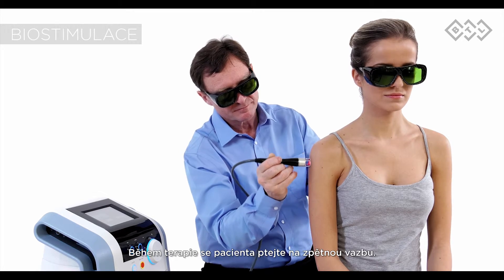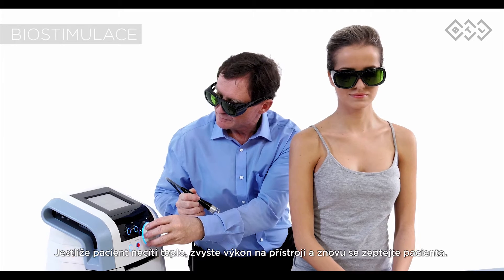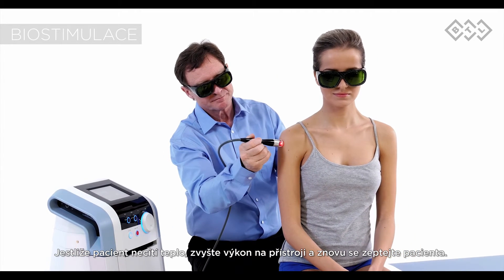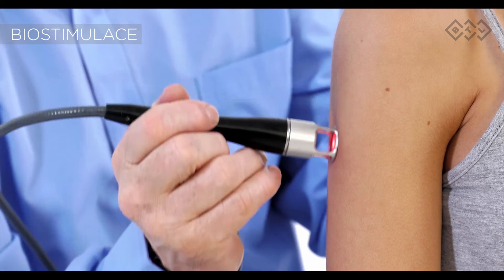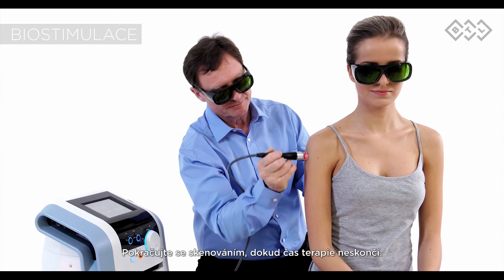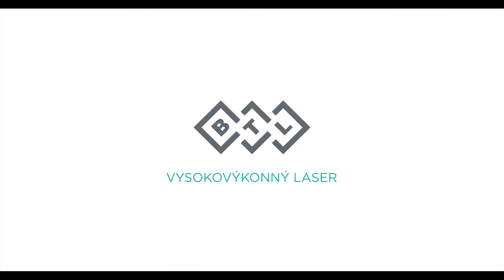Ask for patient feedback throughout the therapy. If the patient feels no warmth, increase the power on the device and again confirm with the patient. Continue with the scanning motion until the therapy time is up.